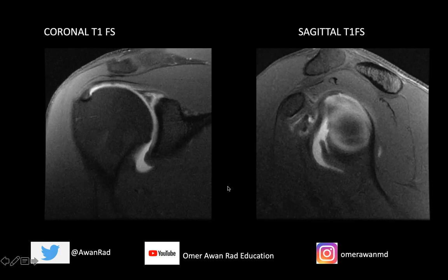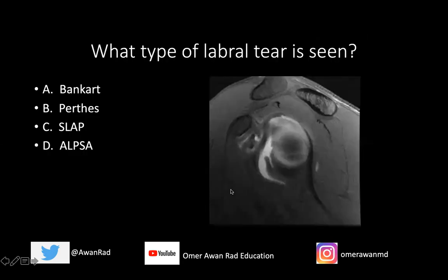The question I have for you is: what type of labral tear are we seeing here? Is this a Bankart tear, a Perthes type of labral tear, a SLAP tear, or an ALPSA lesion? This will test your understanding of the alphabet soup of shoulder imaging.